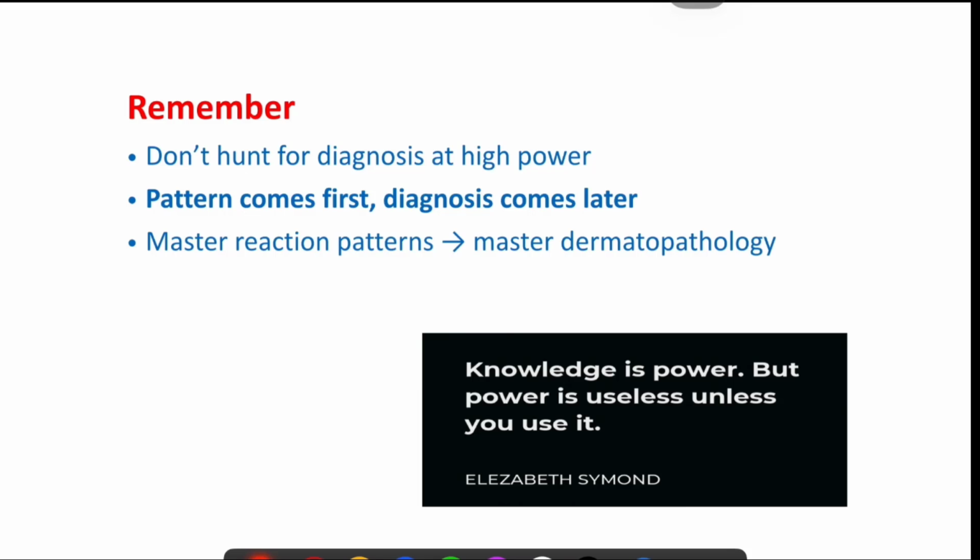So start the microscopy of skin biopsy and daily do at least 1 to 2 skin biopsy slide microscopies so that you can have confidence to identify patterns, and you can easily identify some of the common diseases like lichen planus, psoriasis, and most important, bullous lesions.